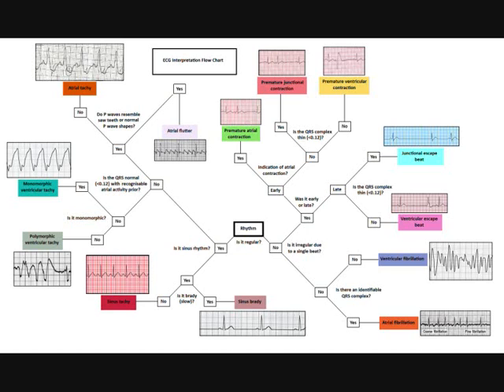If we go back one step and it's irregular due to a number of beats, but there is an identifiable QRS complex, then in this case it might be atrial fibrillation. You can see there is a QRS, but it's not regular. There is no ordered rhythm in that atrium, and you can see the coarse and fine fibrillation, just like in ventricular fibrillation — the other two kinds of fibrillations I wanted to include.